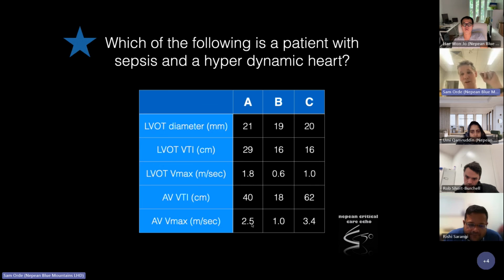And the flip side is you can underestimate the severity of the aortic valve stenosis with a ventricle that is not functioning well at all. That's the low flow, low gradient aortic stenosis. So it is important to understand that flows, or the loading conditions, make a difference.